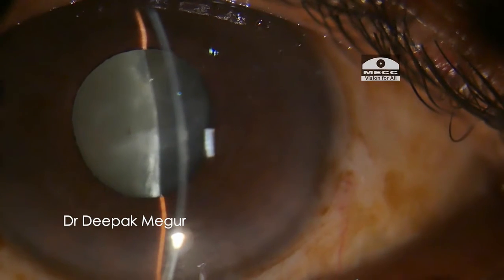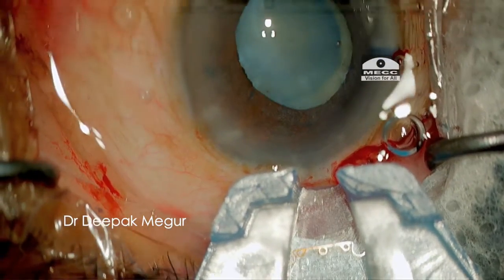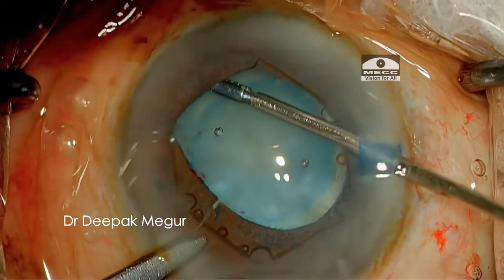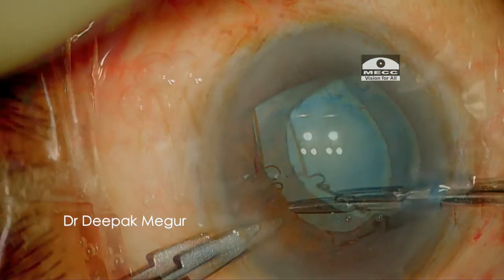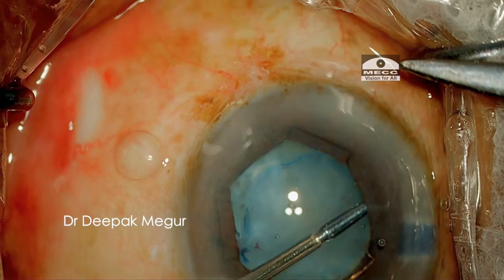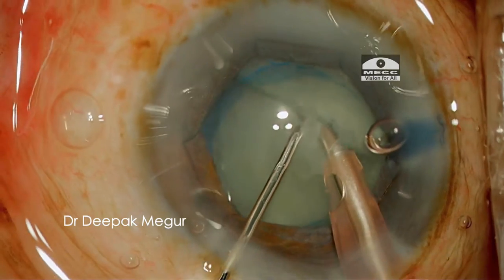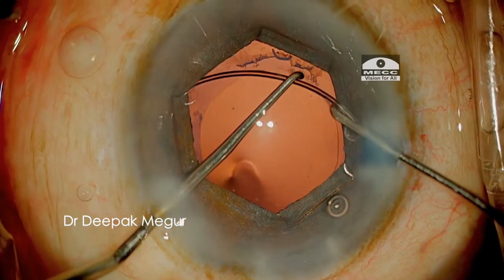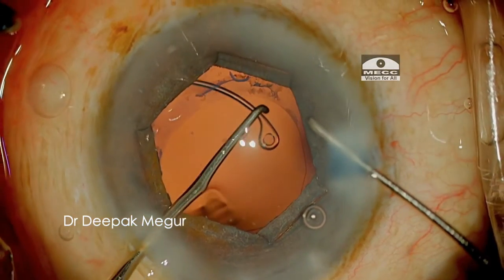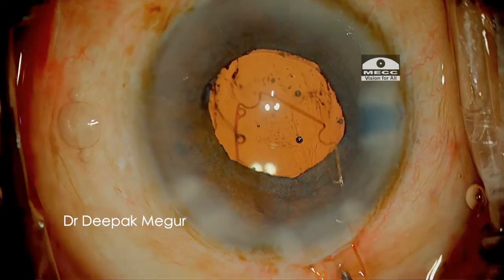This is an extremely shallow anterior chamber. We can see how the 75-micron thin BHEX can easily be tucked under the pupil margin. Despite the shallow chamber, every step is so controlled and safe, and it allows so much space for the FACO probe and other instruments. The BHEX never comes in the way of IOL implantation.